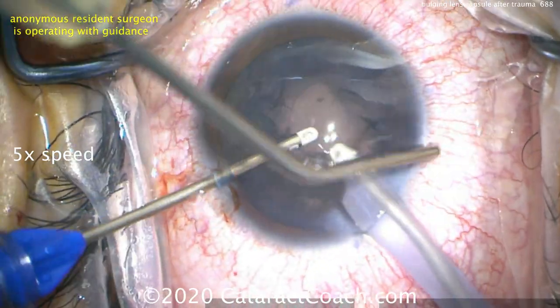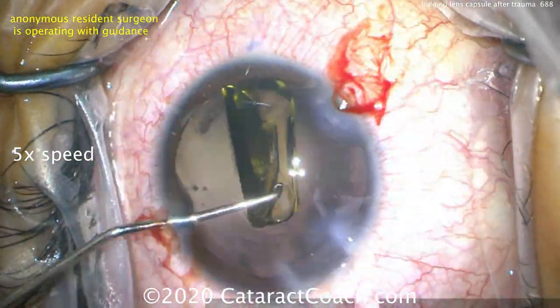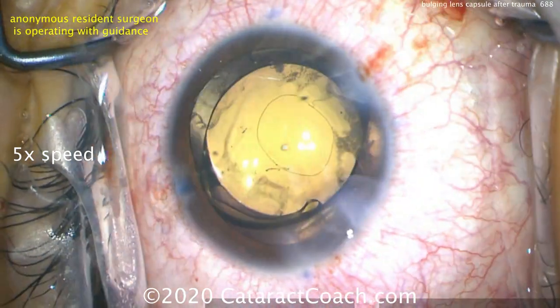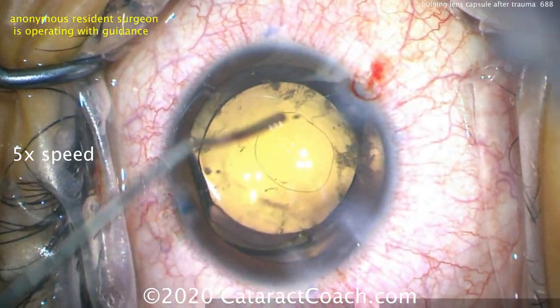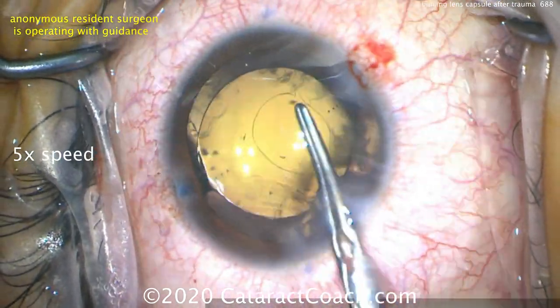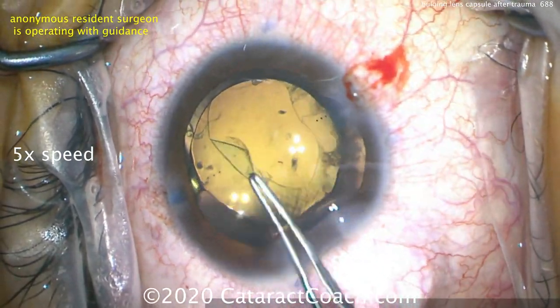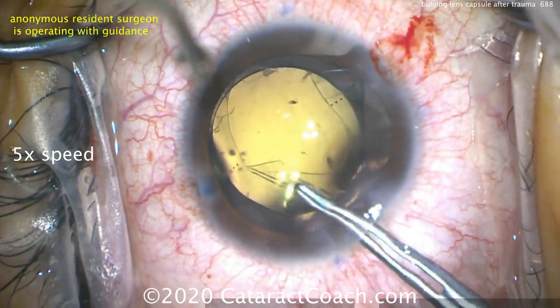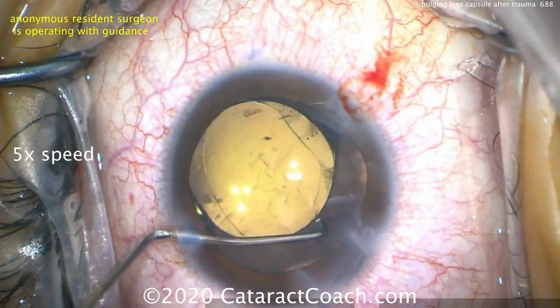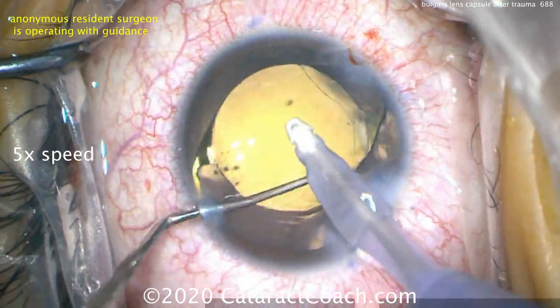We'll clean up all the lens cortex, and we're left with a clean capsular bag and a tiny rhexis. The IOL is placed in the capsular bag first — this serves as a guide to decide how big to make the rhexis. With the eye filled with viscoelastic, baby scissors are used to make a small cut in the anterior lens rim and then continue the capsulorhexis. The rhexis pulls out a little, but that's a good save — bring it back in and keep it continuous. Though it's not a perfect circle, it won't affect the refractive outcome in the least. The lens is rotated into position after removing viscoelastic from behind the optic, and the case goes beautifully.